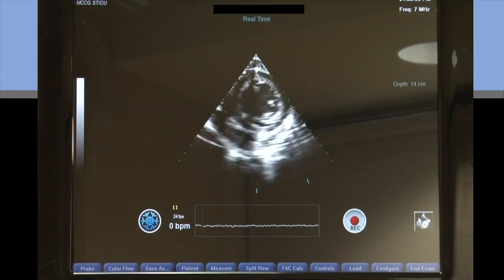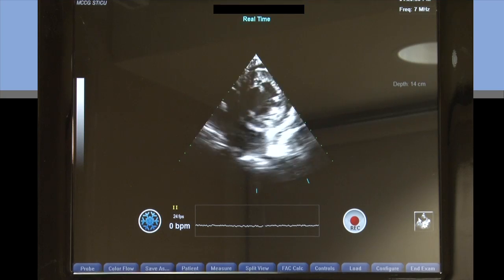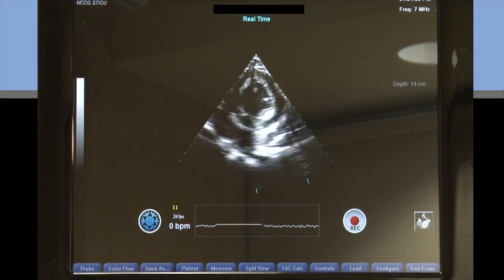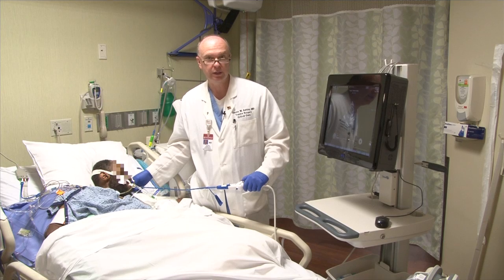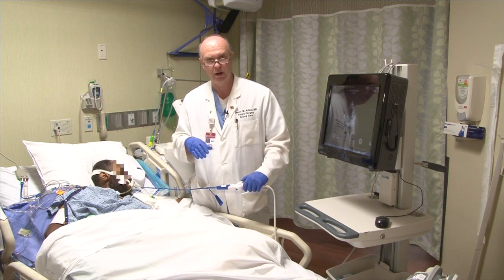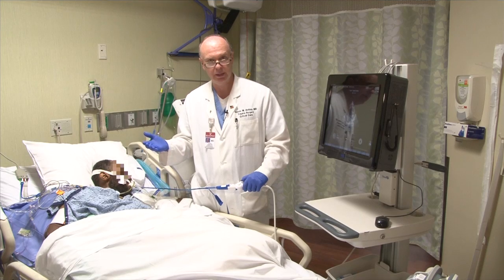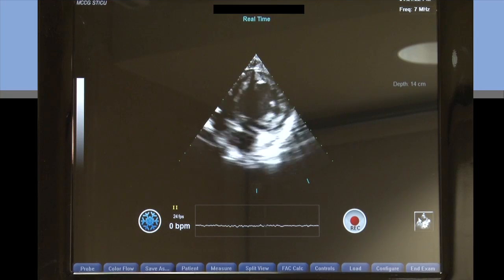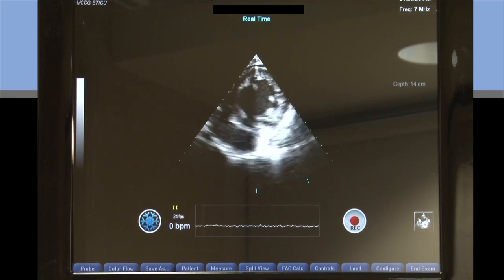You can see here I'm in good position. I've got good contraction of the left ventricle. I'm at the level of the papillary muscles — that's where we want to be so that we're consistent. Anytime we take a measurement or look at volume status, we want to make sure we're always at the level of the papillary muscles so we're comparing images. If we do an exam this hour, give fluid, and do an exam again in another hour, we want to make sure we're at the same cross-sectional area of that ventricle so that if there's been a change, we can pick up on that.